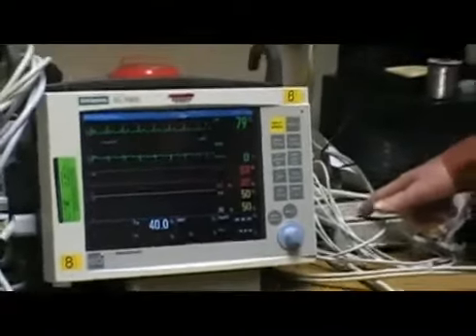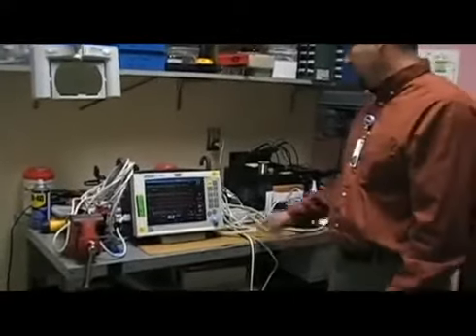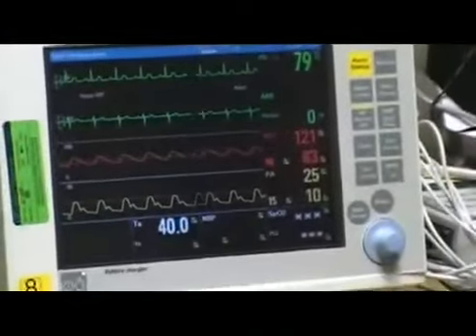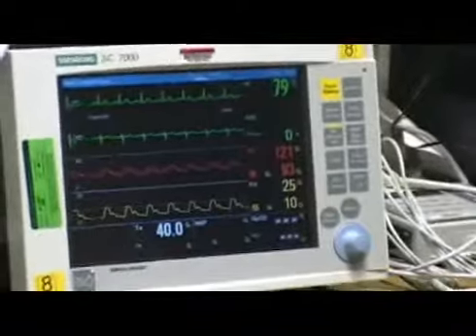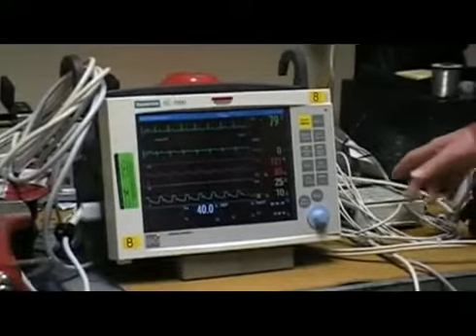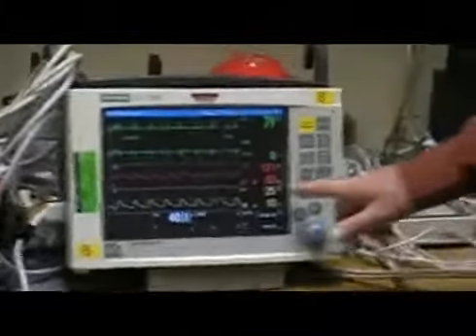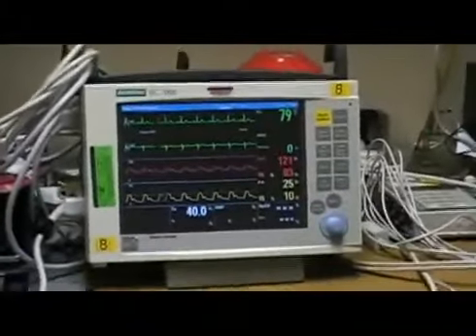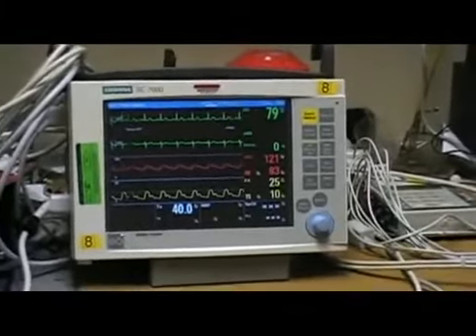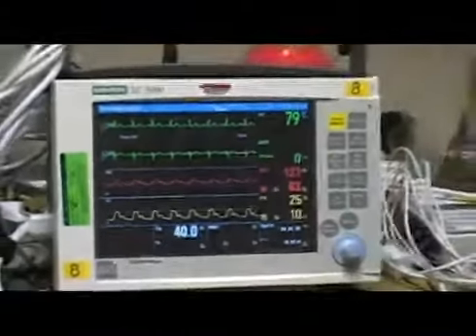Then we go to the arterial. The simulator sets up 120 over 80. So then we have 121 over 83, that's within limits. That's also 5 millimeters plus or minus. And then we're going to want to check for the PA, so it looks like it's already actually set. The simulator is supposed to be 25 over 10, and that one's right on the money. And then that's it for the invasive blood pressure testing. If those weren't right, you'd go into the Biomed menu and recalibrate it.